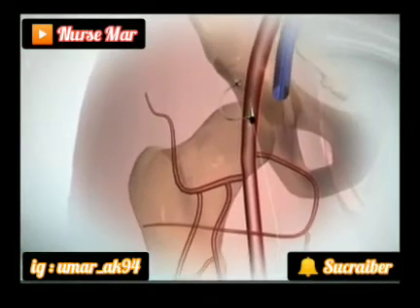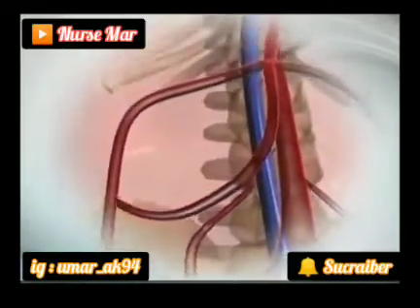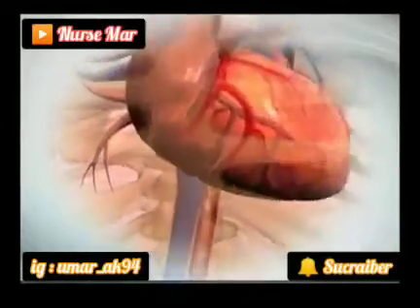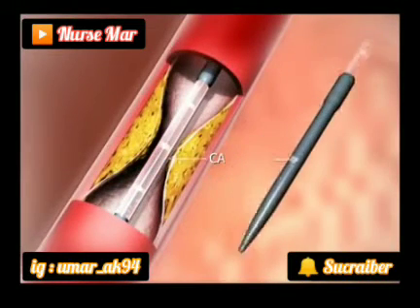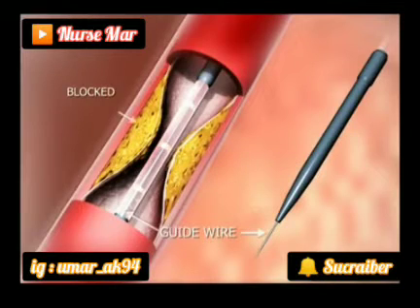The blood vessel is punctured with a needle and a thin guide wire is inserted into the artery and advanced towards the blocked segment of the coronary artery. Then, a long, thin plastic tube called a catheter is passed over the guide wire towards the blocked segment of the coronary artery.